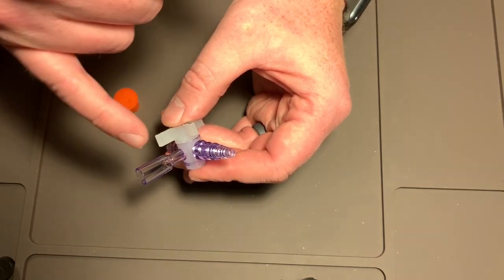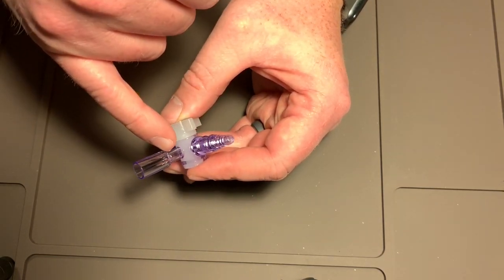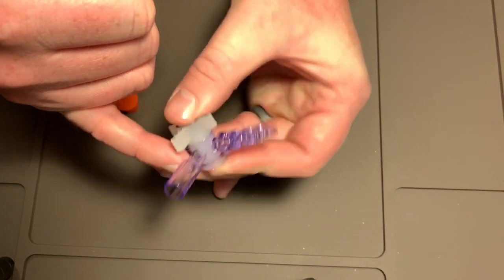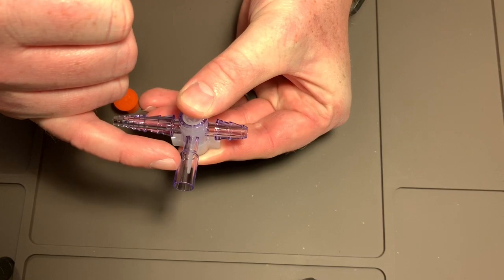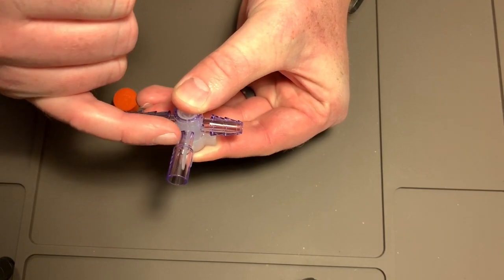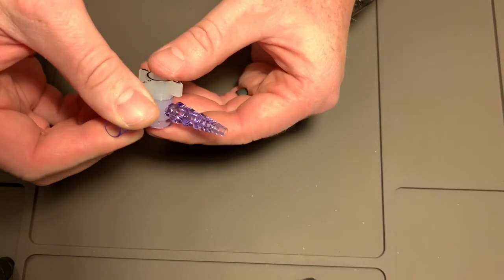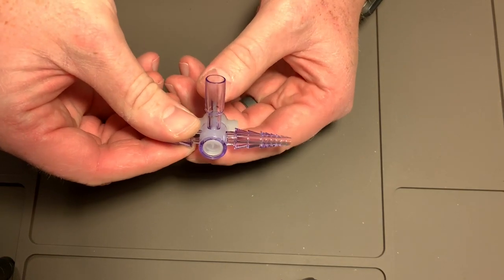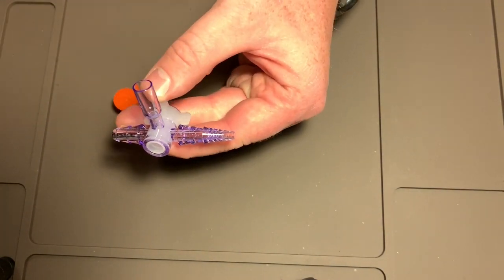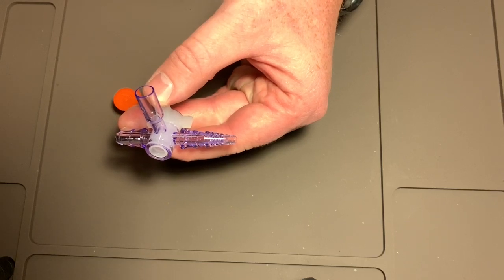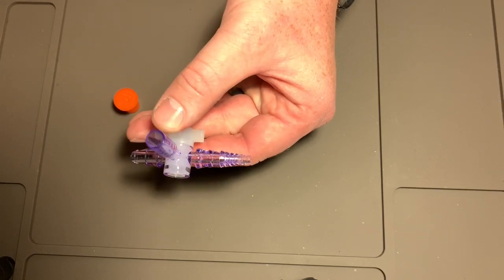And over time that can gunk up your valve and you might need to replace it. Also, whatever medications you're giving, that means some of the medication stays here in the tube portion rather than actually going to your patient. So that you can actually get a good visual of this, I'm going to drop a little bit of milk in here so you can see something that's got a little bit of color rather than just water.